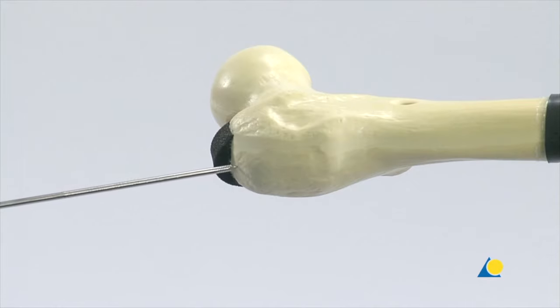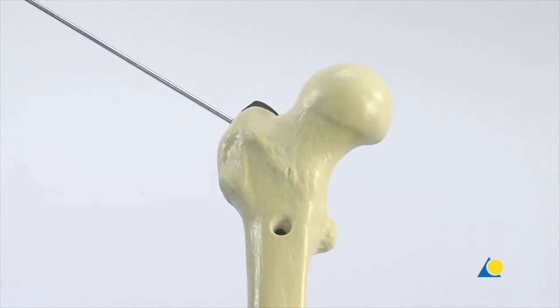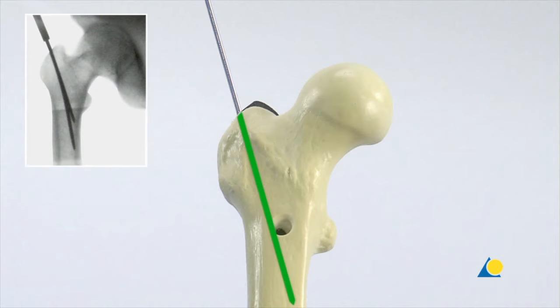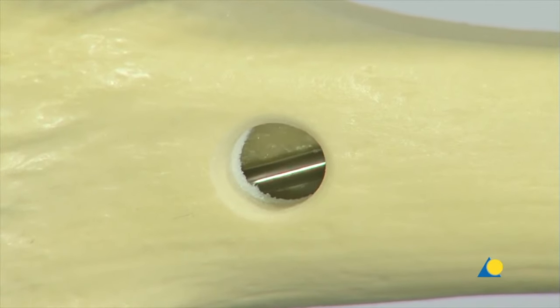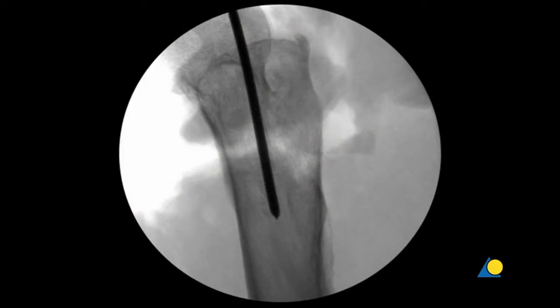The 3.2mm guide wire is secured in the universal chuck with T-handle. With a lateral inclination of 10 degrees in the AP plane, the guide wire is inserted approximately 15 to 20 cm into the medullary canal. The guide wire should be aimed at a point 2 to 3 cm below the lesser trochanter. The direction can be followed by looking through the hole in the bone model. The guide wire should not penetrate the medial cortex of the femur. In the lateral view, the image intensifier is used to verify that the position of the guide wire is straight and centred within the medullary canal.